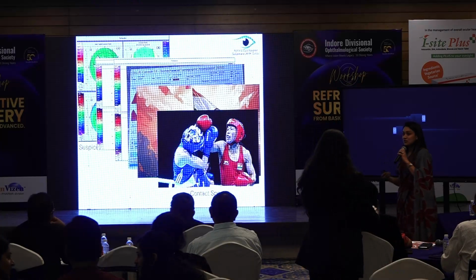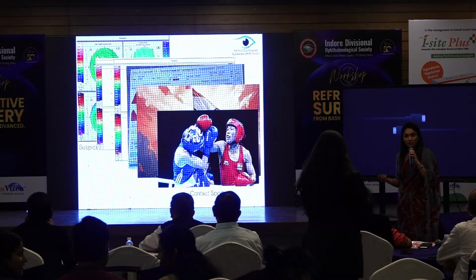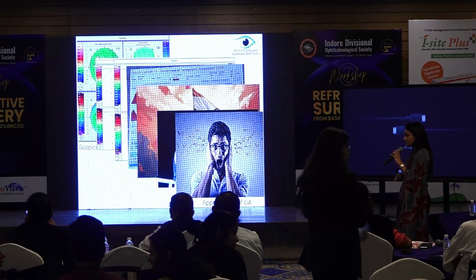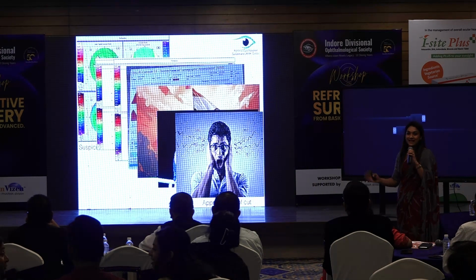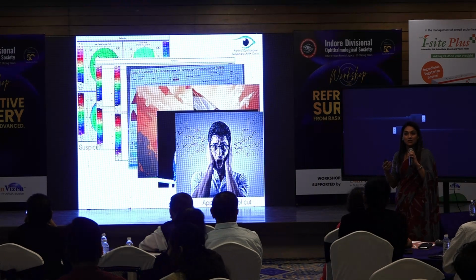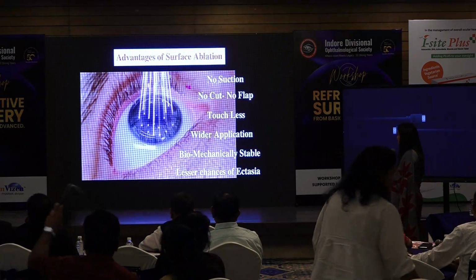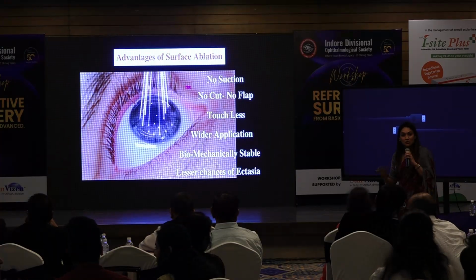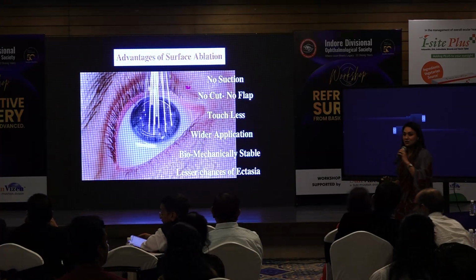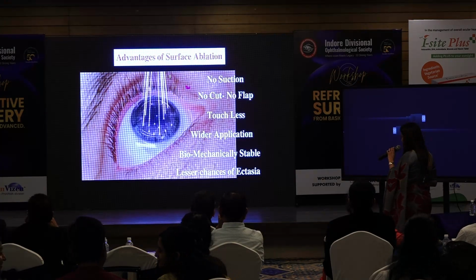Or probably the patient is into active contact sports, so you want to avoid any kind of a cut on the cornea. And some patients are just skeptical and very apprehensive about any cut. So that's when trans-PRK or surface ablation comes to rescue, because we know that surface ablation is a no suction, no cut, no flap procedure. It's also marketed as touchless LASIK nowadays.